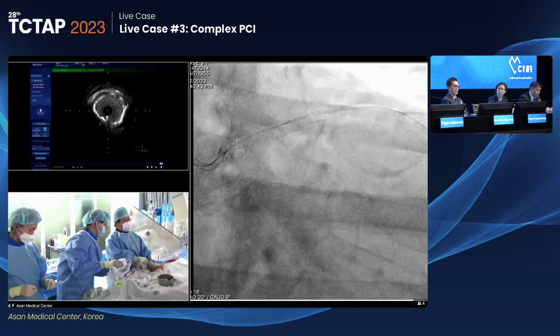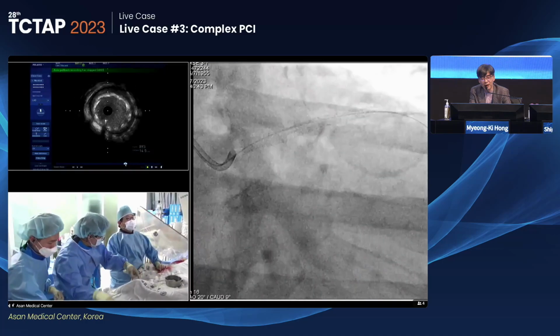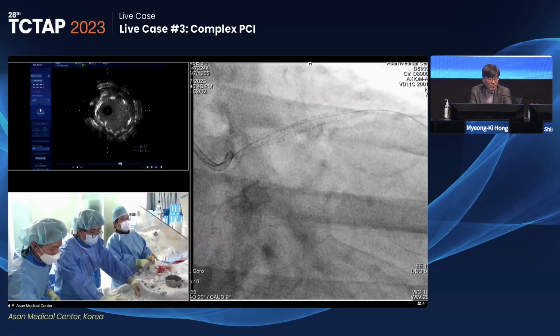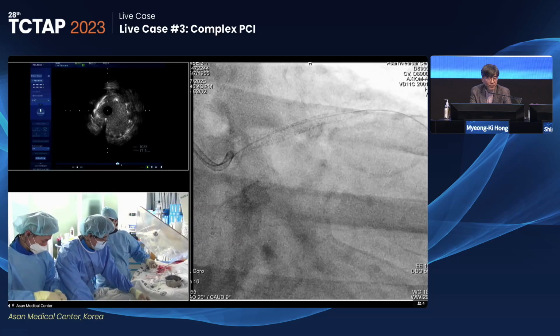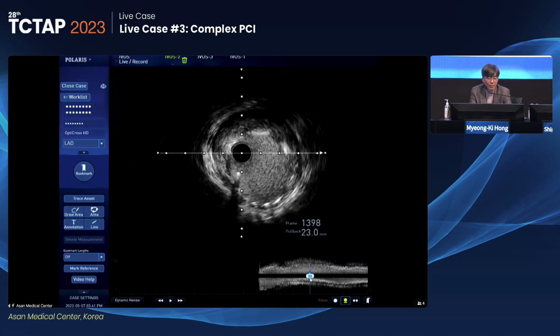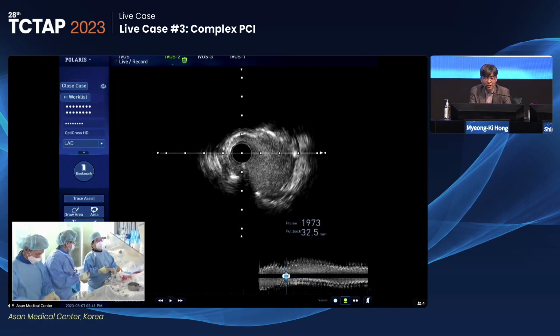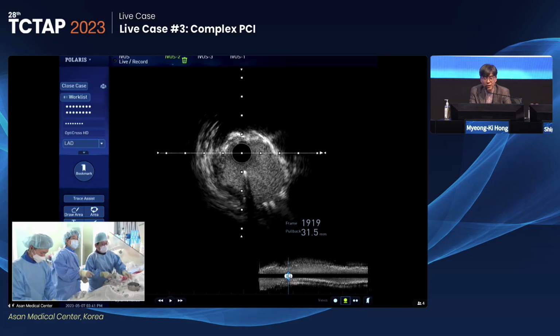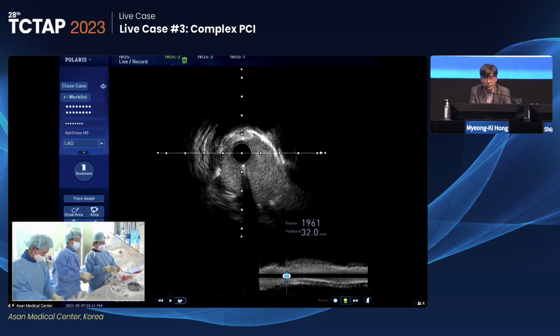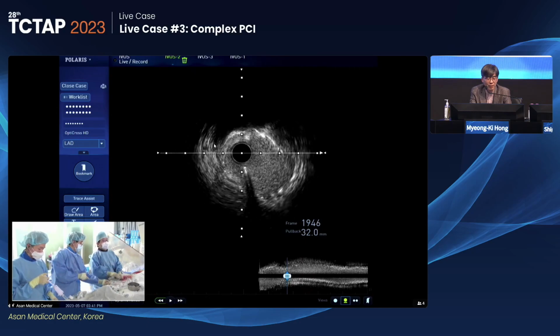So what is the minimal stent cross-sectional area at the proximal LAD and the left main? Yes, I will measure the proximal LAD MSA. Give me the high pressure balloon. Looks like more than 10. Looks fairly big, some eccentric, maybe the ostium of the circ. No, LAD.